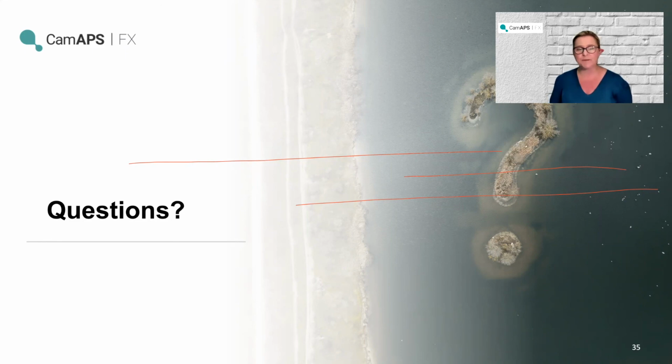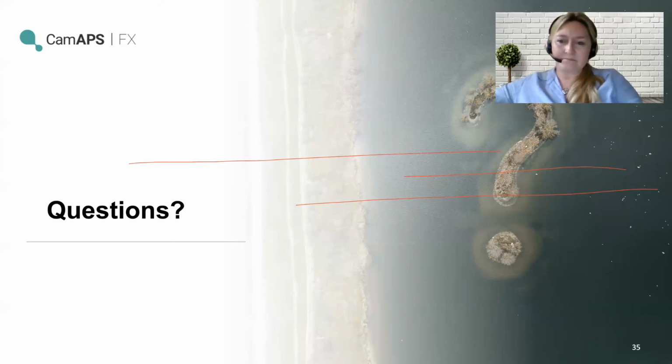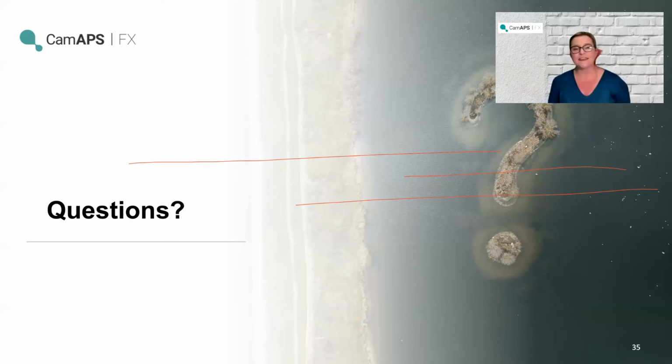There was a question about CGM and Dexcom. Dexcom's the only CGM that is able to be used with CamAPS at the moment. You were saying the Dexcom G6 will come, and G7, yeah. And obviously the app is designed to be interoperable. So as CGM develops and there are new players in the market, there may be opportunities to link with different systems, but the system we've got in place is what we have at the moment.